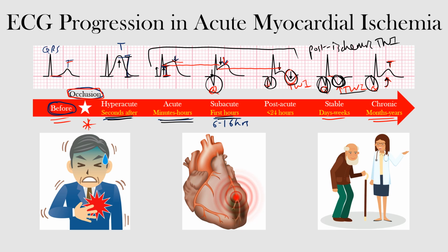Well, that's the end of this lecture. We discussed the EKG progression from myocardial ischemia to infarction. I hope you learned something.